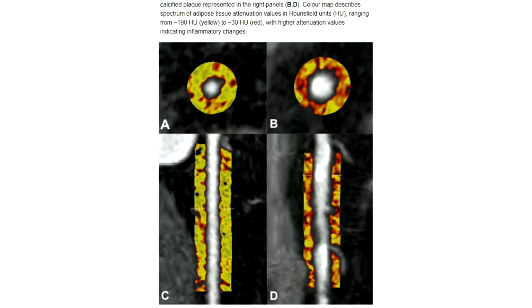Here you see visualized what that looks like, because it doesn't look like that if we see it, but the imaging companies make it possible that we start seeing it. On the left is panel A, that's what a normal situation would look like. On the right is panel B, that is what an inflamed situation would look like. So the Hounsfield units are going to go from minus 200 or something in the direction of minus 60, 40, and so on.